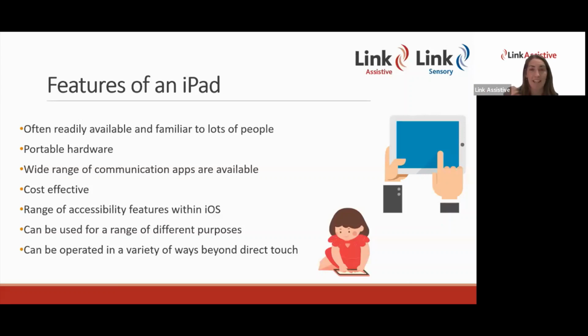iPads can be used for different purposes. They can be used for communication through a communication app, but they might be used for recreation or surfing the internet, or emailing, using Facebook Messenger. It can be used for a range of different things, and it can be operated in a variety of different ways. It might be via direct touch, it might be via an alternative access solution. So iPads can be a really nice option for people to use as a communication device.